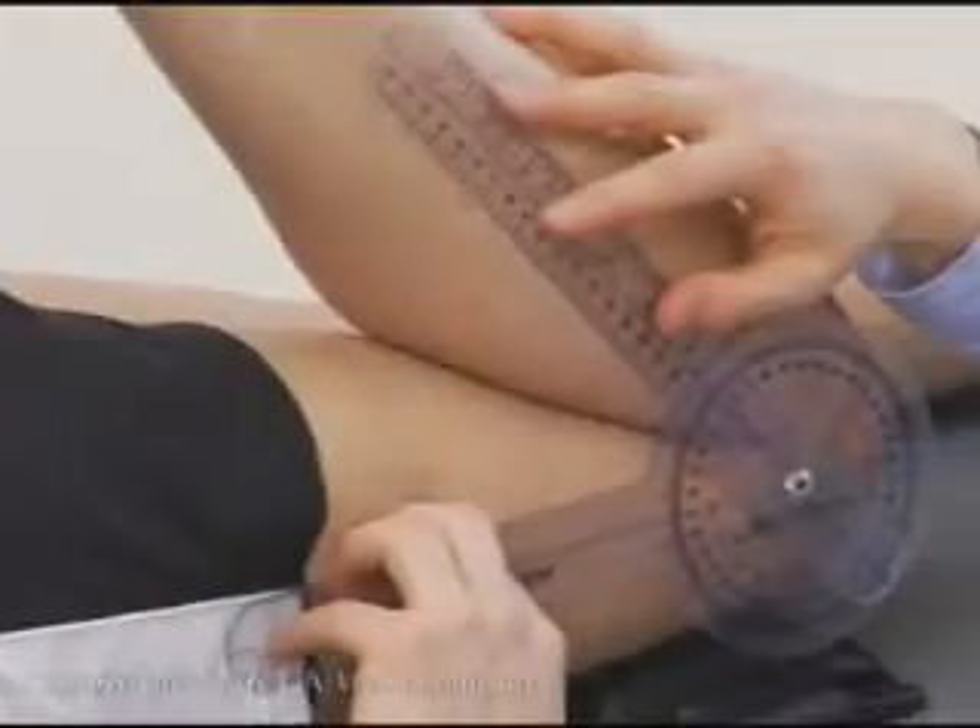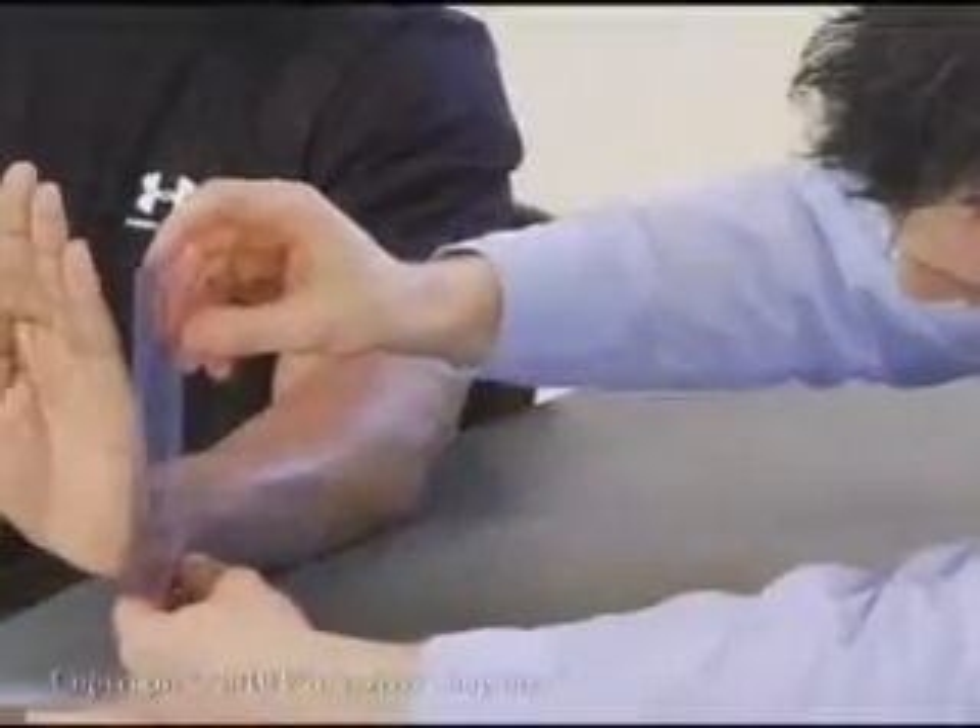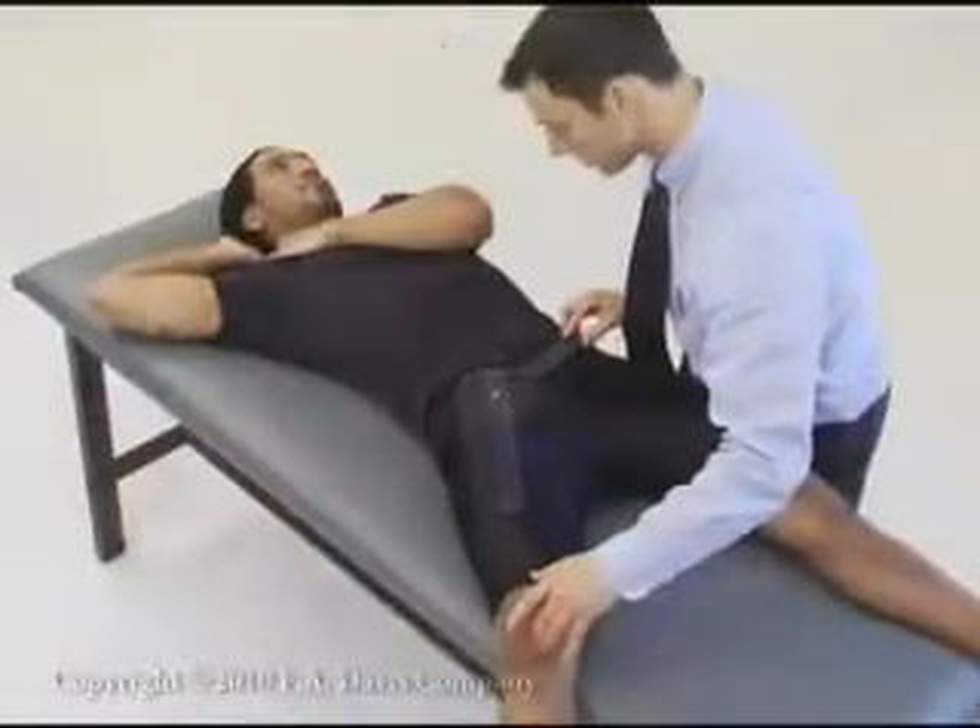Goniometry can be used to measure joint range of motion. It can also be used to indirectly measure muscle length. This video collection includes techniques to measure both.